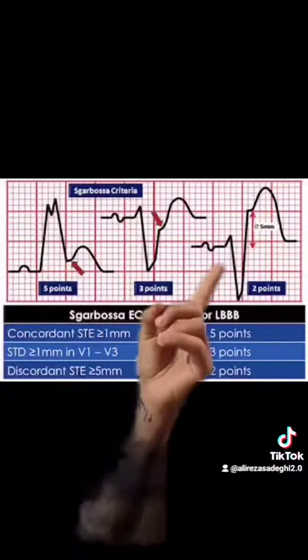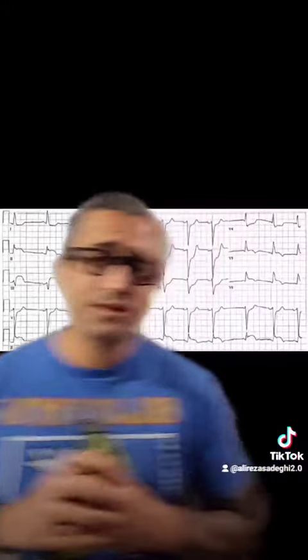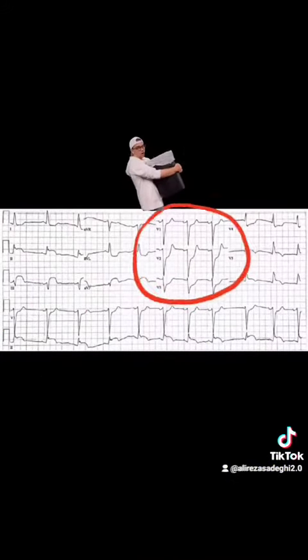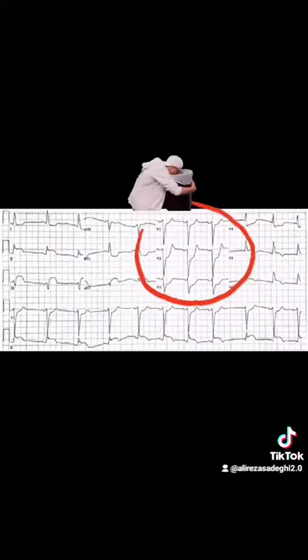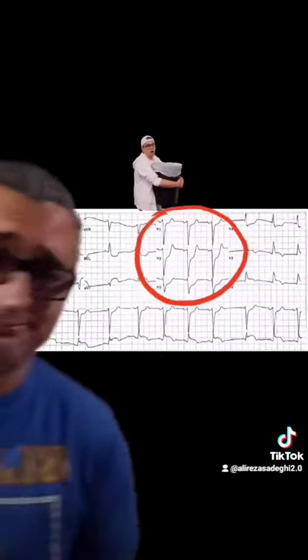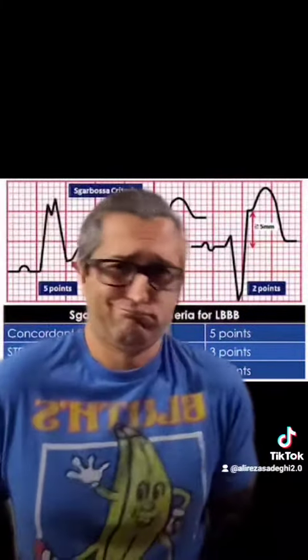Does Sgarbossa mention that? Yes, it does. Now let's look at our final example. Look at leads V1, V2, and V3. I have a QRS complex that is going down and also an ST segment that is going down. Abnormal — that's all I need to know. Does the Sgarbossa criteria mention that? Yes, it does.